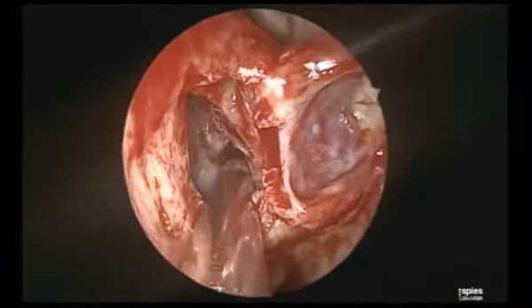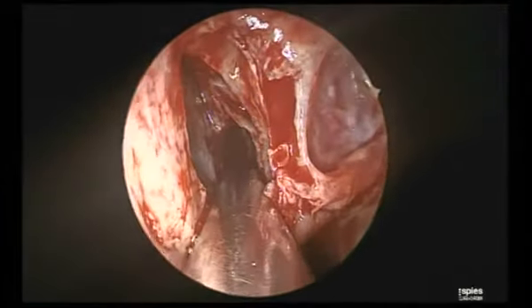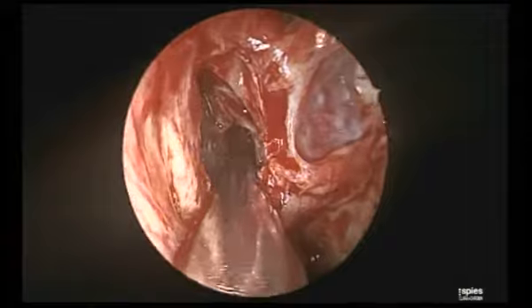The safest way is to keep it flush with the septum. The sphenoid ostium is just flush with the septum. Can you see? Flush with the septum, yes. And medially, and inferiorly, not superiorly.